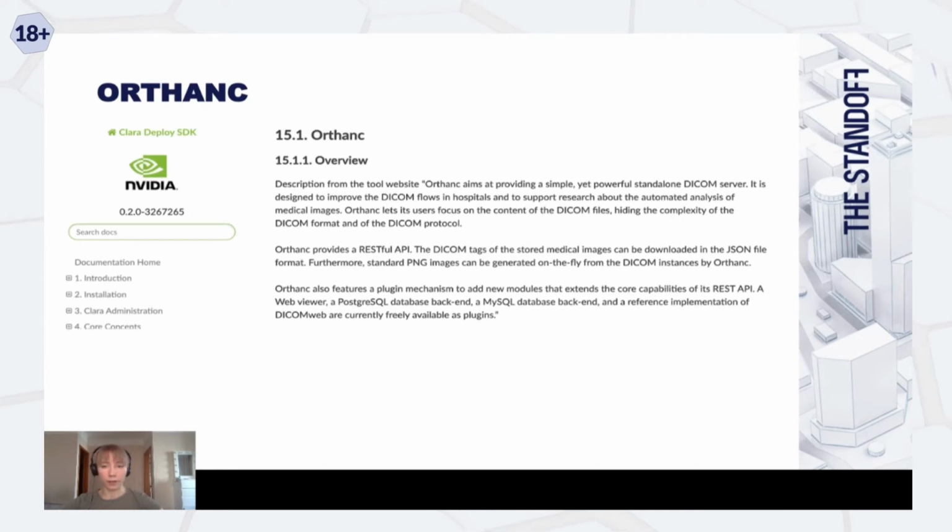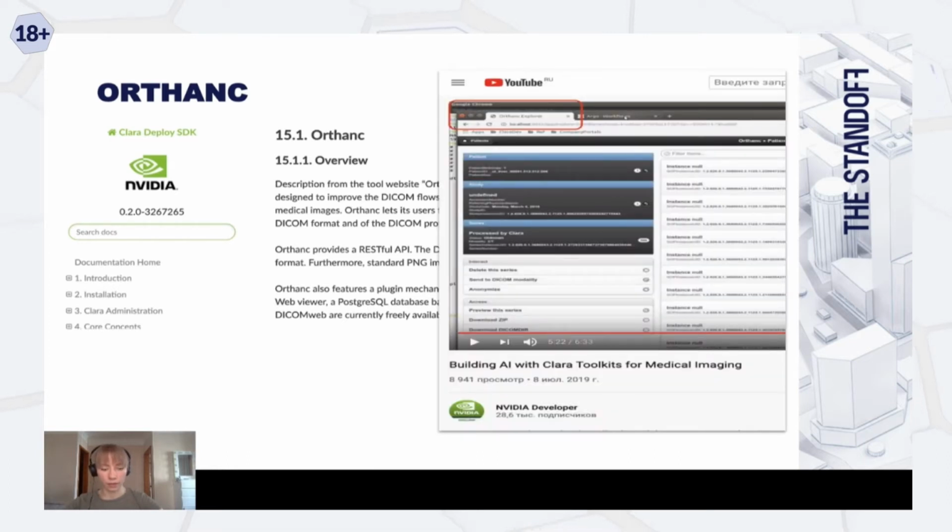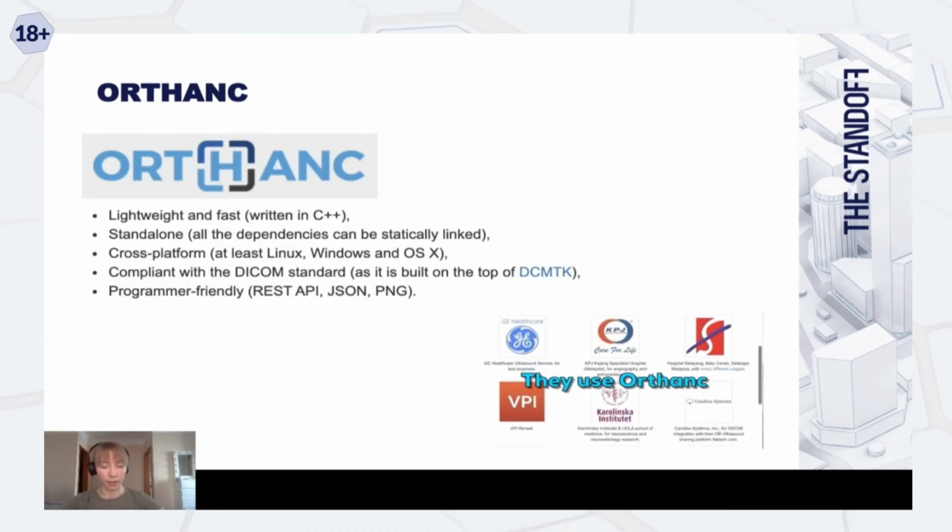Orthanc. Orthanc is a DICOM explorer. NVIDIA recommends it for the management of the input data in your network. Orthanc is convenient. It has a web shell, and to work with it, you only need a browser, and that's it.